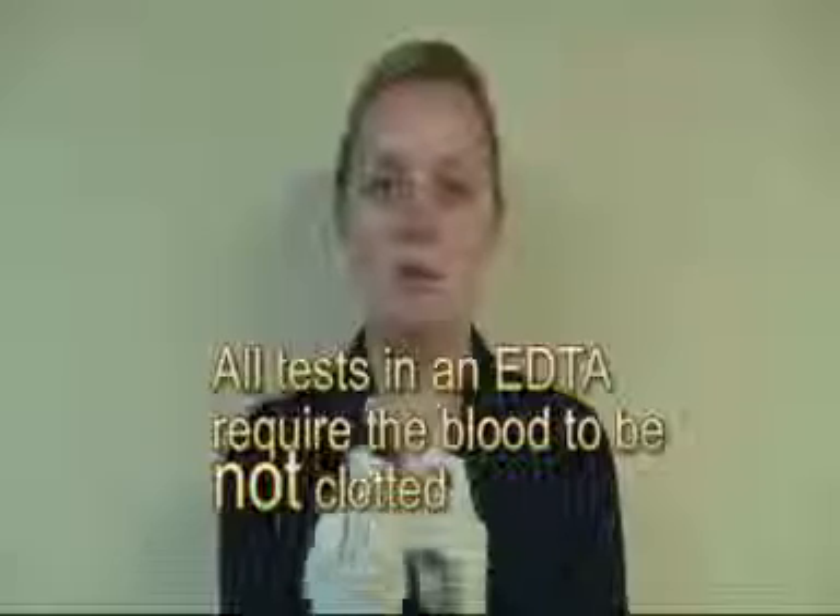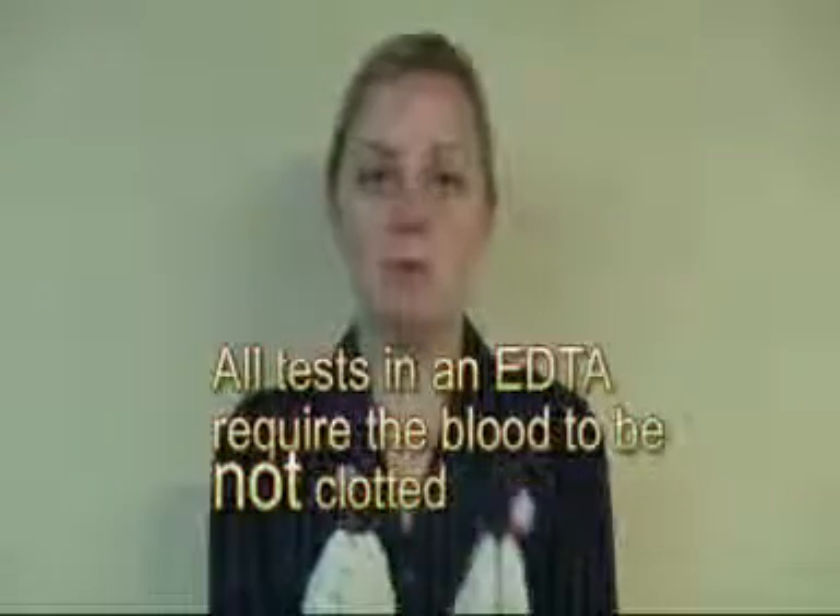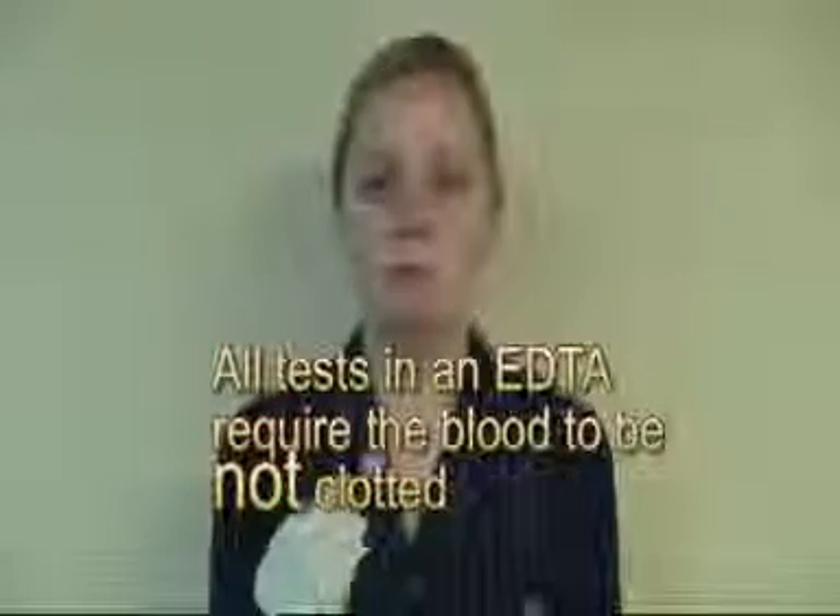If the doctor has ordered a full blood count, we will need to fill the EDTA to 250, put the lid on and invert. Start your other tube, collect that one to 250 and invert also. If additional blood is required, we then top up the first tube and the second tube. Remember to invert at both stages.